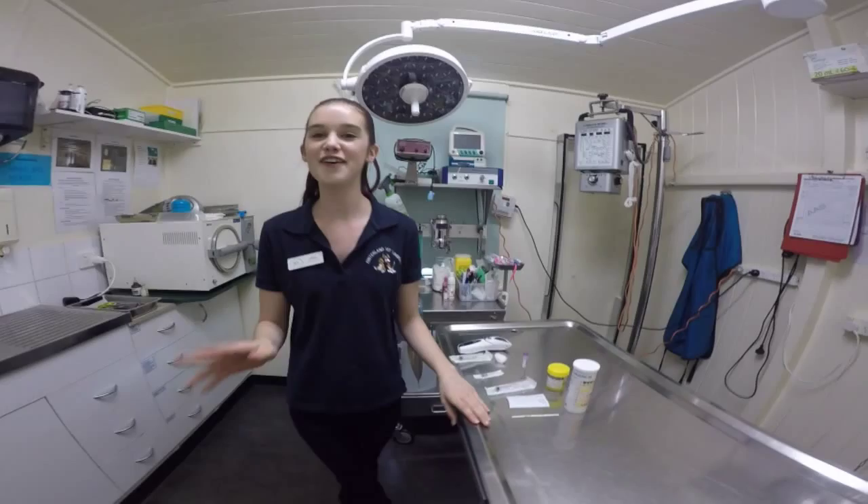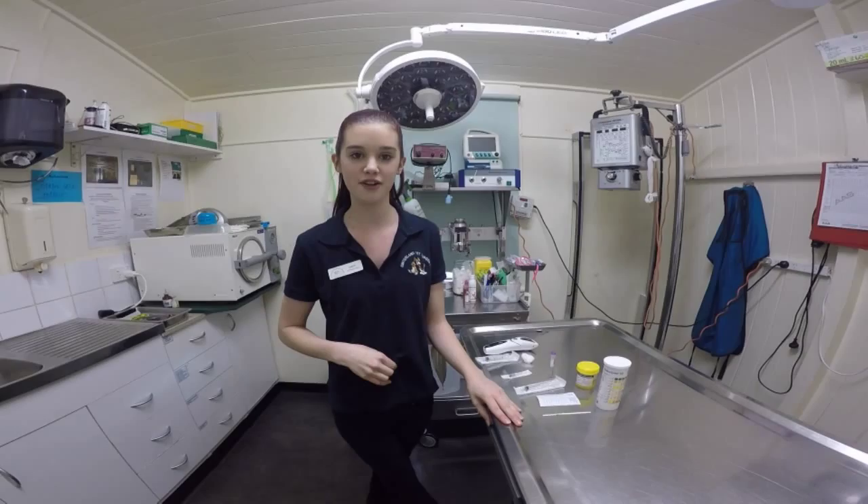First I will take a sample from the jugular vein. My patient for today is a canine Staffordshire Terrier cross. Her name is Ruby. More importantly, I will wash my hands first.